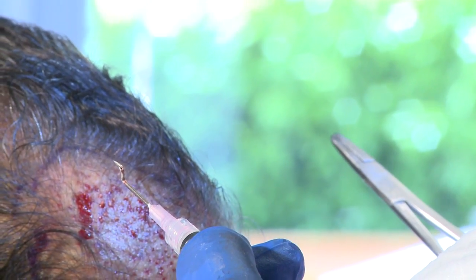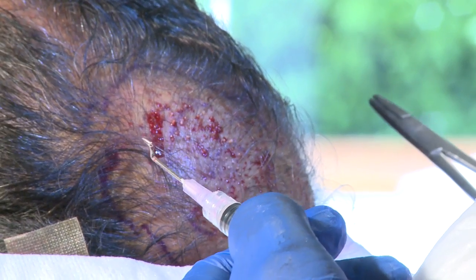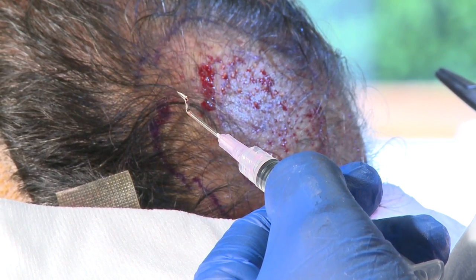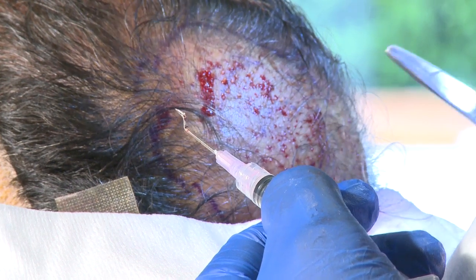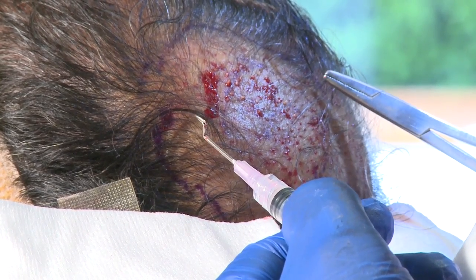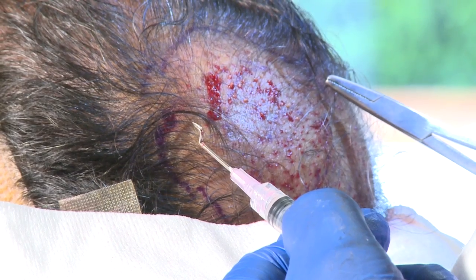When you place a graft, there should always be like 1.5 millimeters of tissue protruding, kind of a cobblestone look, because as we all know, when wounds heal, they contract, and they'll pull that graft in. And what you don't want is these countersunk grafts creating little divots wherever you placed a graft, and then you've got a little divot with a hair coming out. So we avoid that by leaving the graft just about 1.5 millimeters of tissue protruding.